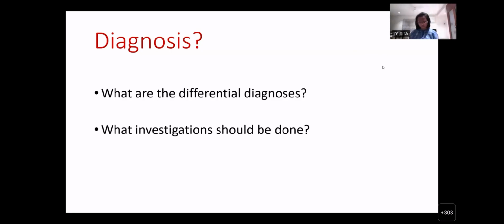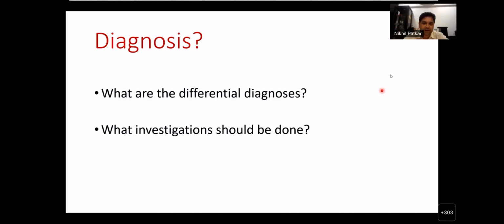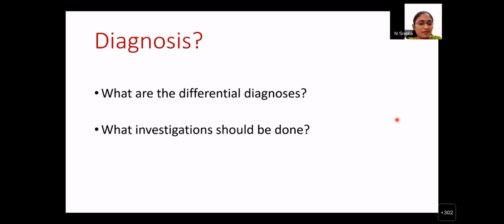So let's take a poll. How many of the other students agree that this is a monocytic leukemia? What other thing do you think this could be? Acute myelomonocytic leukemia. Myelomonocytic leukemia. What about the rest? Do they have anything more intelligent or more different to say than this? And monocytic leukemia with NPM1 mutation. Okay, monocytic leukemia. Now, okay, so let's not get into the diagnosis.